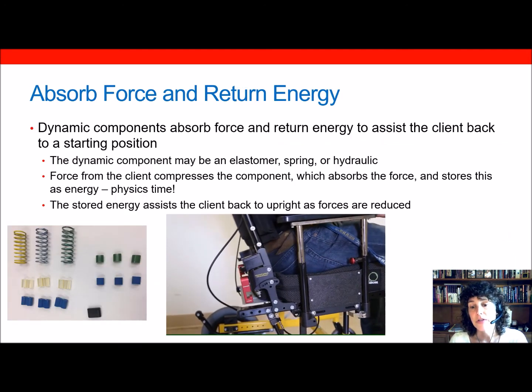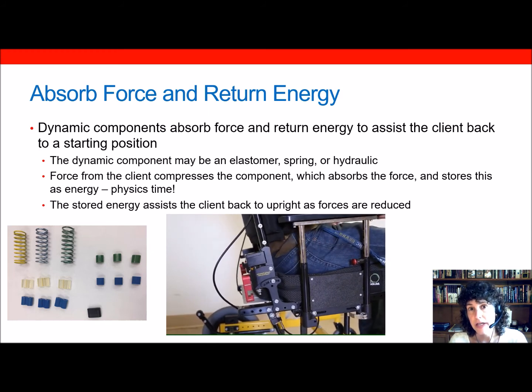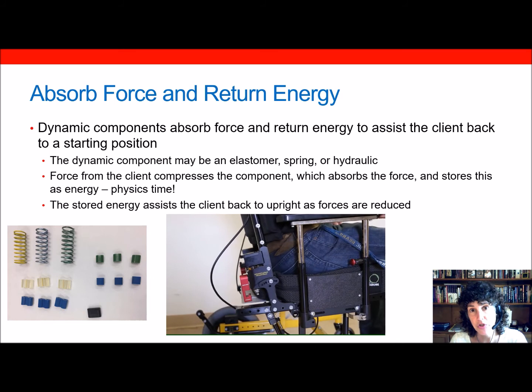The next part of our definition is that the dynamic component absorbs forces created by the movement of the client and returns this as energy. This gets into physics a little bit, and that's not my deal. I'm an occupational therapist. So the dynamic component might be an elastomer, a spring, a hydraulic, and the force from the client compresses that component. It absorbs some of the forces from the client and it stores that as energy. Why is that important? Well, the stored energy is what assists the client back to upright.